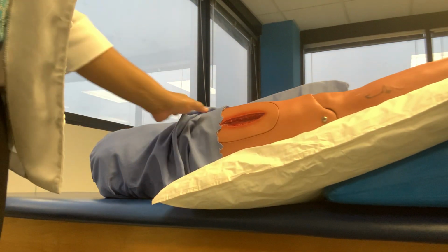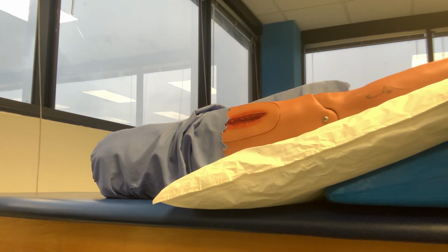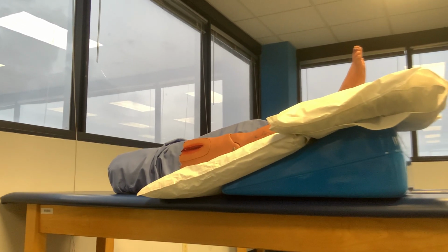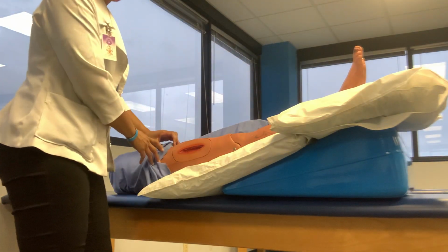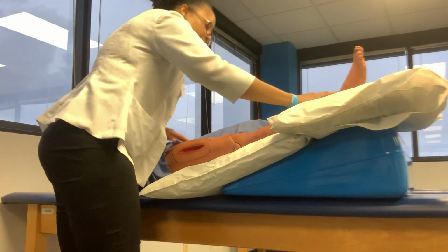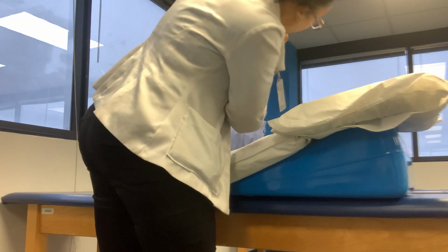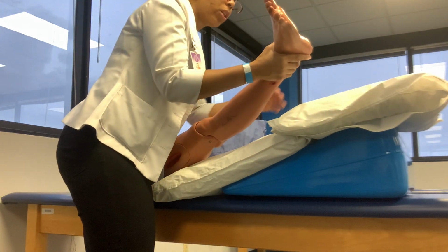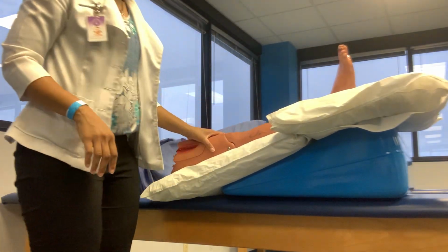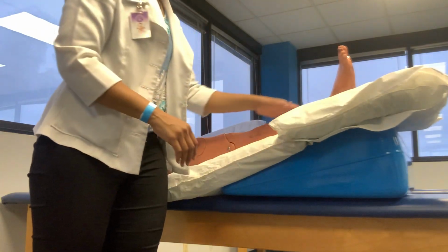Okay, so once the leg is nicely elevated and fully supported, basically from gluteal fold all the way to the heel, the next thing I'm going to do is a thorough skin inspection. I'm looking at the skin, anterior, lateral, and medial, and I'm going to slowly bring their leg up to check posterior. I make sure I look at the heel, and I look between the toes as well. So you do a thorough skin inspection, and we're going to ignore the fact that our test dummy does have some contraindication. But you completely inspect the skin.